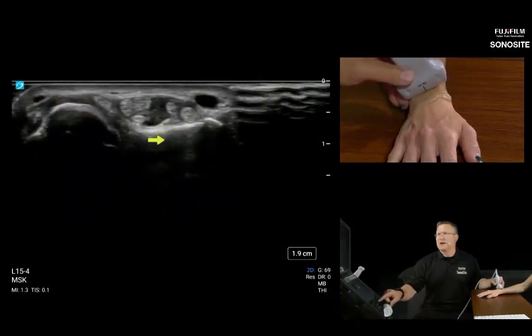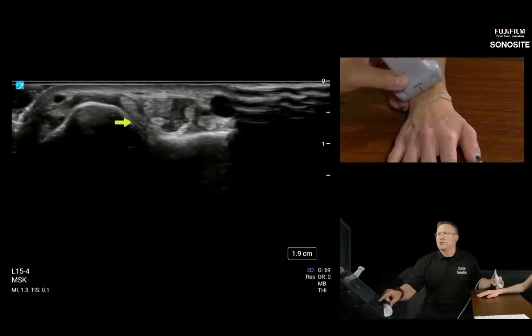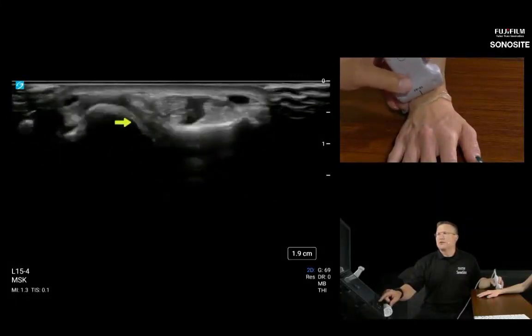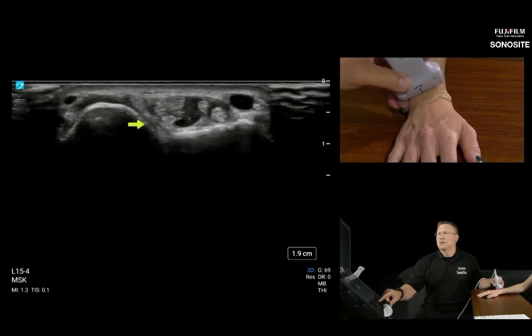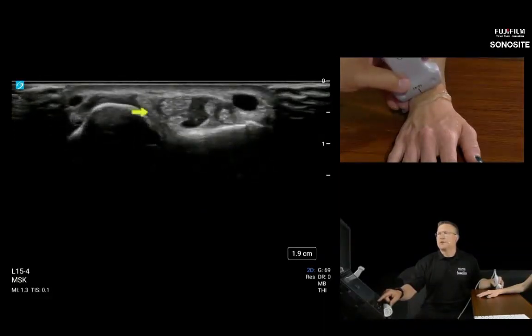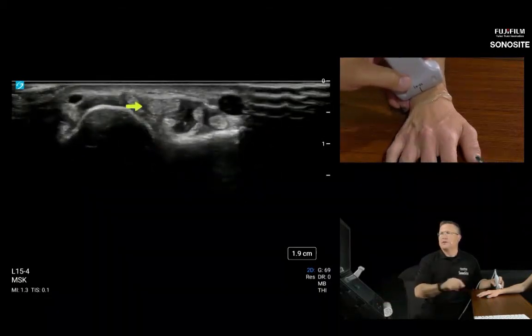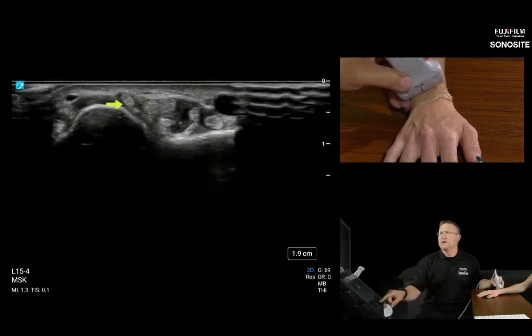Here I can see the radius and the ulna. And above this joint, we see this little anisotropic hammock shape of another retinaculum here. And here's the 5th compartment. And I'm going to have our model wiggle the pinky in this case, and it's going to elevate the extensor digiti minimi.